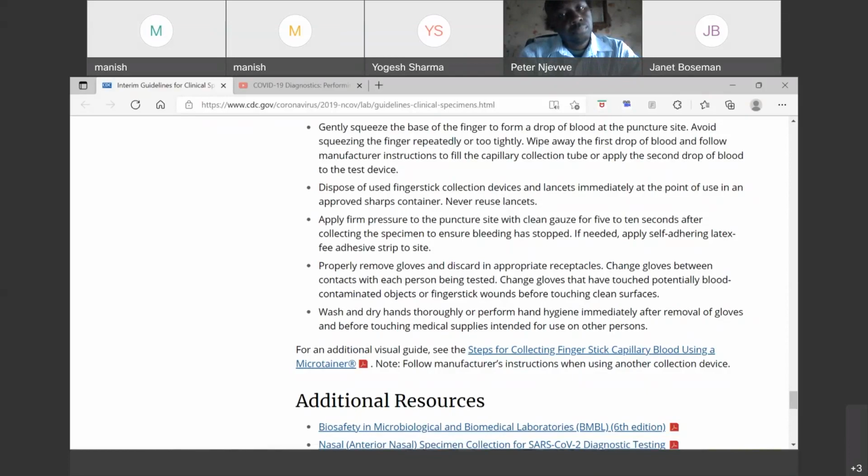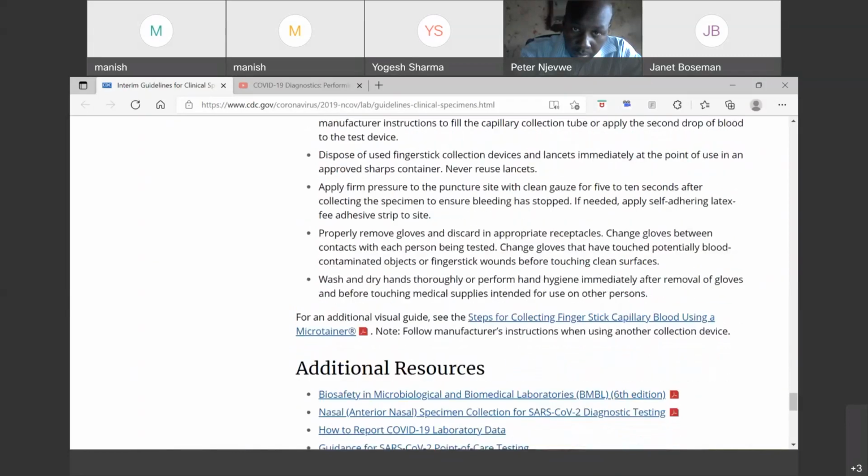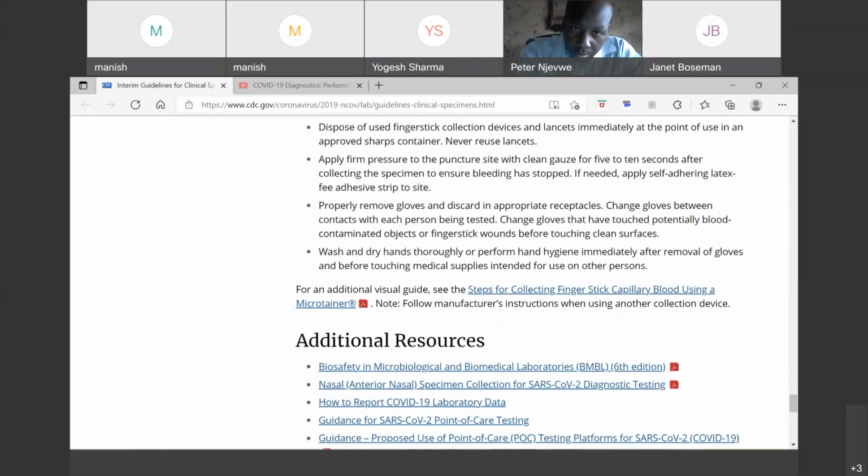So the bleeding should stop. You have to ensure that. If it has not, then we can apply the self-adhesive latex-free adhesive strip to stop the bleeding. Properly remove gloves and discard in an appropriate receptacle. Change gloves between contact with each person being tested. That is important. We have to change the gloves from one patient to another patient to avoid any kind of cross contamination.